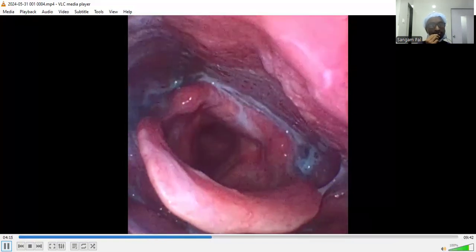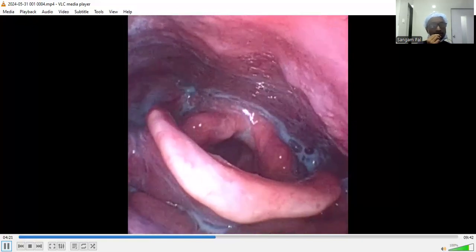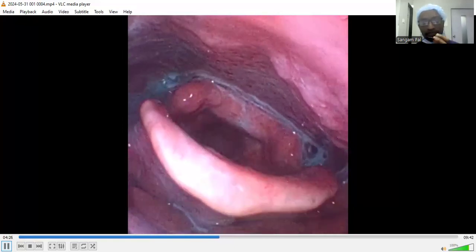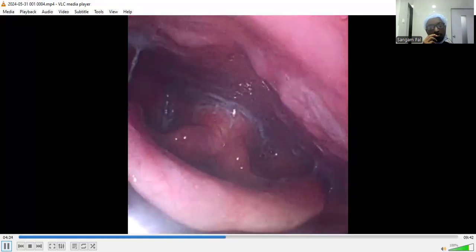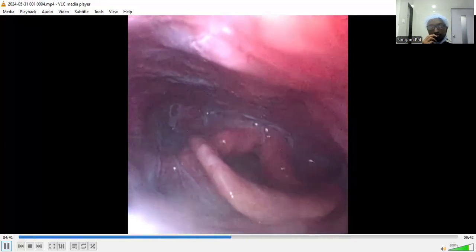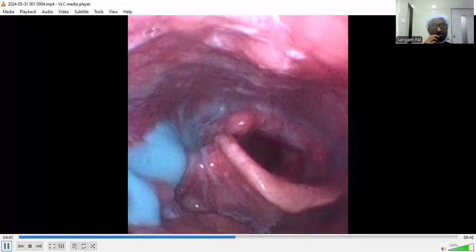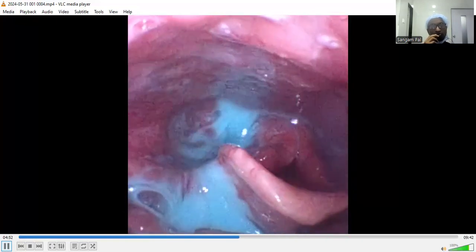And so this patient's swallowing for liquid is okay. A little bit of penetration may be there, but definitely there is no aspiration, and see a little bit of fluid has gone, but then he cleared it out by coughing maybe. So after this liquid we have given the patient, so again this pre-swallow, the liquid has gone but no aspiration.